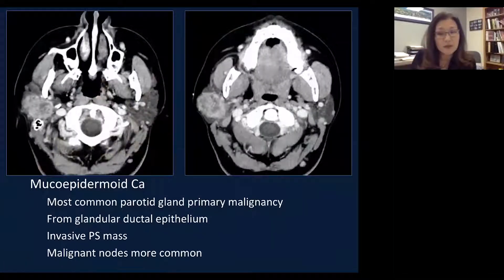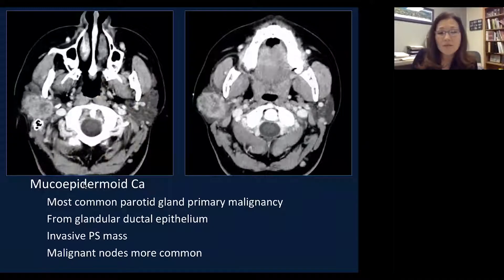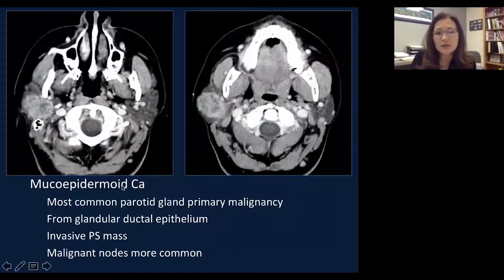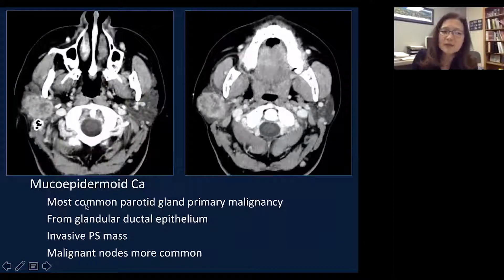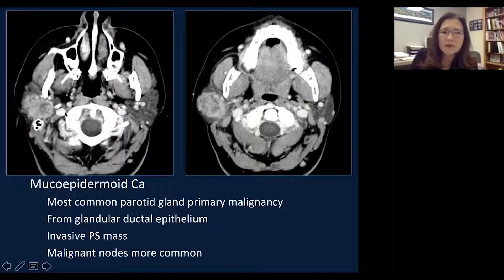Malignant parotid gland lesions — only 20% of parotid gland tumors are malignant, but there are several pathologies to keep in mind. The first is mucoepidermoid carcinoma, which is the most common parotid gland primary malignancy. This lesion arises on the glandular ductal epithelium. Compared to the benign parotid gland lesions shown in part one, it looks more irregular and a little more ill-defined.